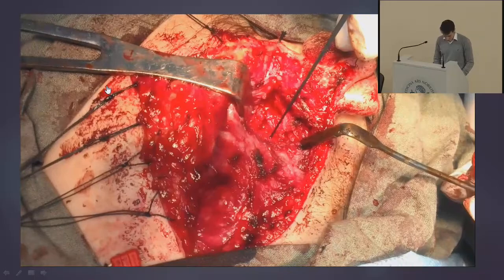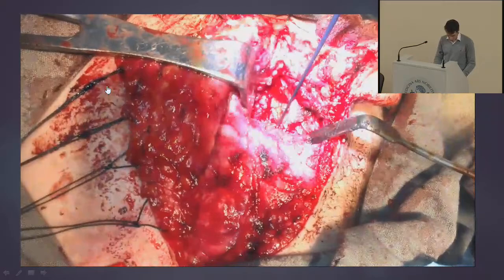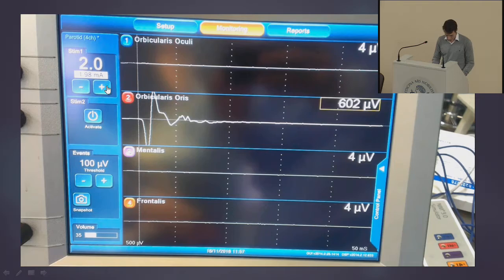Here is a small video showing the main principle of how intraoperative neuromonitoring works. The stimulation probe touches the nerve structure. The nerve becomes excited by the strength of a current, and the subsequent contraction of the innervated facial muscle occurs. Then the amplitude of the muscle responses, or M responses, is displayed on the monitor. That's how it works, briefly and clearly.